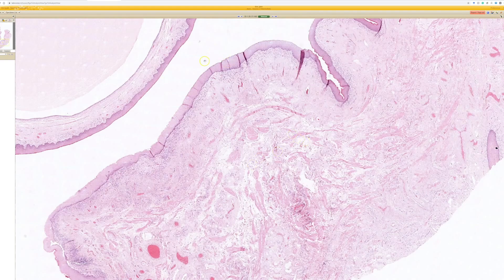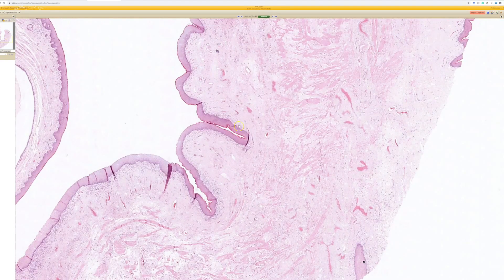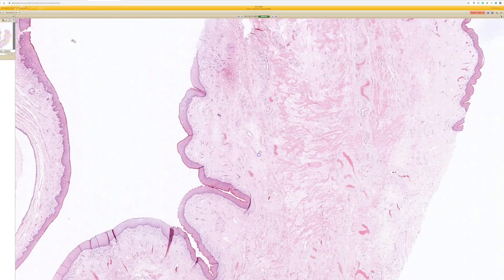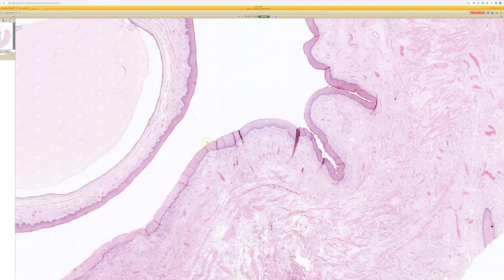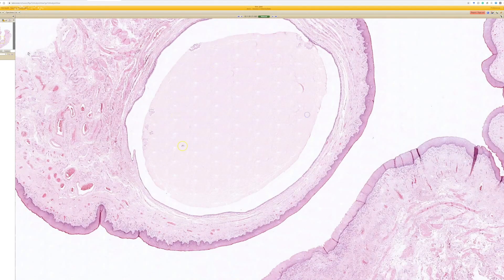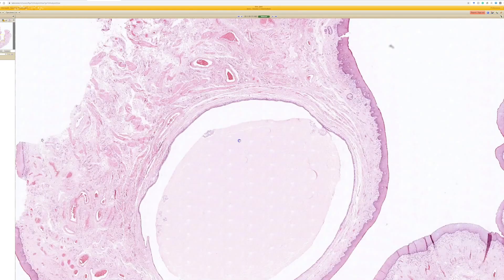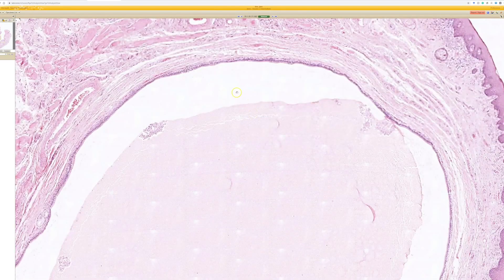Look at all these bright pink bundles here — these are all smooth muscle. Whenever you see skin or mucosa with a lot of smooth muscle bundles under them, always think about the penis, the scrotum, or in a woman the vulva, because you have smooth muscle bundles under the skin in those locations. But here we have a cyst filled with a thick, inspissated secretion in the middle. Let's go look at the lining cells.